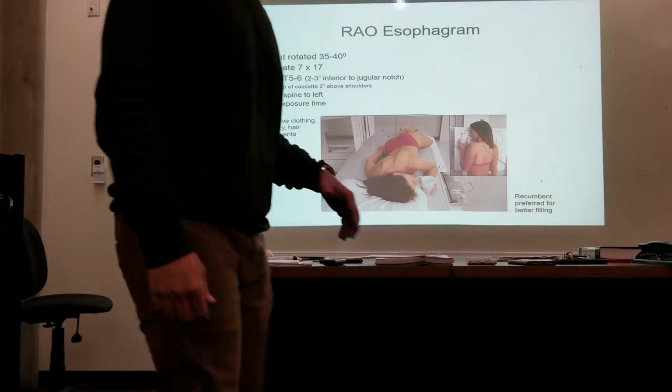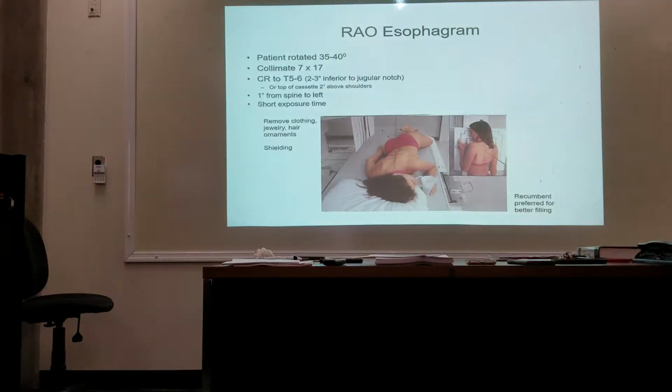All right. So now this is what you're doing. You're going to get a head start. Patient's on the table here. All right, Miss Jones, go ahead and start drinking. Drink and swallow, drink and swallow, drink and swallow, drink and swallow. Boom. Hit your exposure switch. Okay? Exposure is usually done between 3 to 5 swallows. Okay, that's a good fill of the esophagus. Okay? There's no breath hold. It is continuous drink and swallow, and you hit that exposure switch anywhere between 3 to 5 swallows.